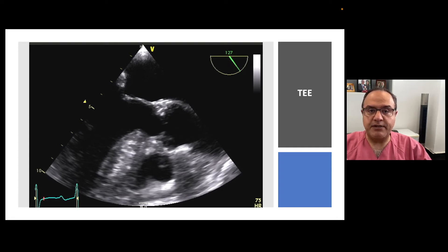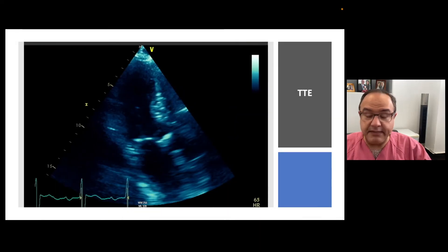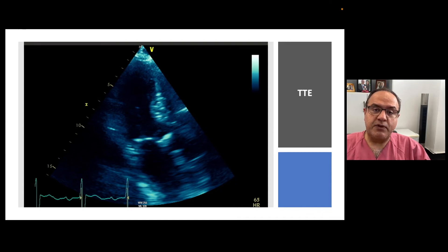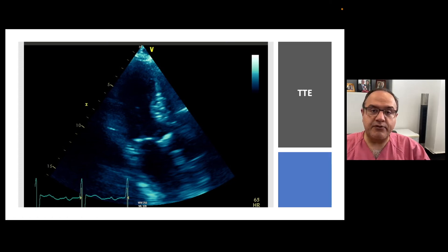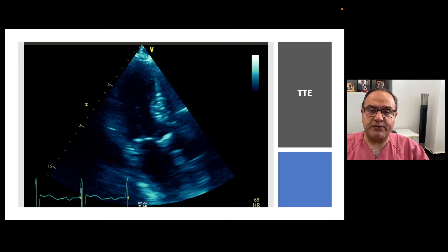We have a prolonged PR interval and a conduction block through the Bachmann bundle in the interatrial septum. On echocardiography we can also see some changes in the interventricular septum. Given these echocardiographic findings, Bachmann bundle block, and the prolonged PR interval, the next diagnostic step would be a cardiac MRI to visualize possible scar in this area, and to exclude diagnoses like sarcoidosis, amyloidosis, and other infiltrative cardiomyopathies.